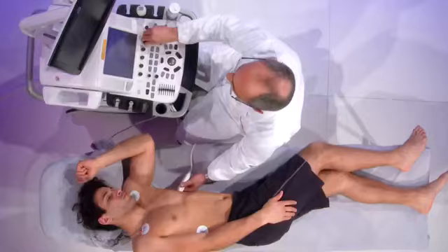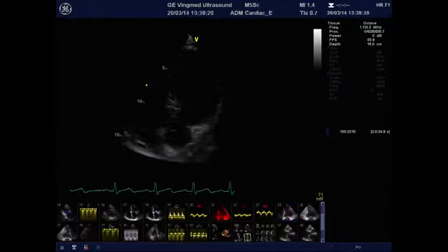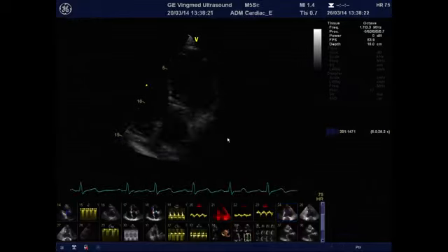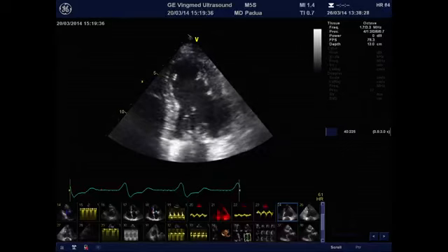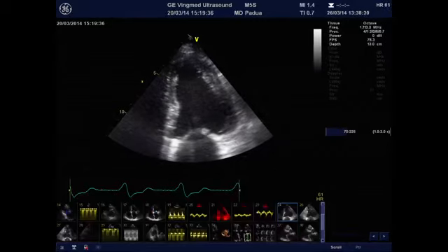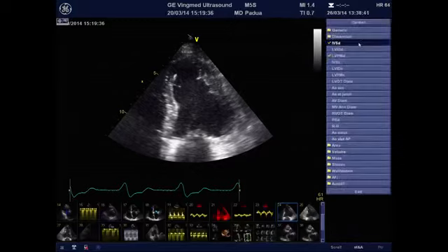And then you take your four-chamber view and the two-chamber view to measure the volumes and the ejection fraction. So the four-chamber view, you stop it, and then you go for the end diastolic frame. Here it is quite difficult because it's a paced rhythm, so more than the ECG, I look at the mechanics of the left ventricle, and then you turn on your screen.